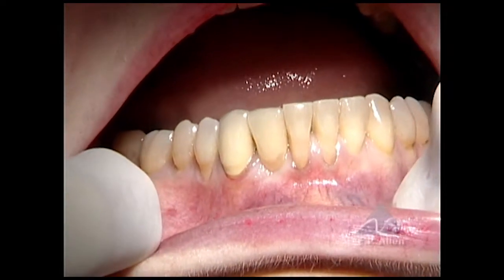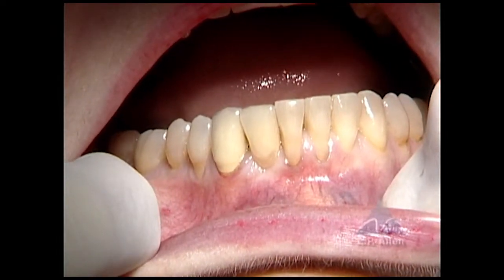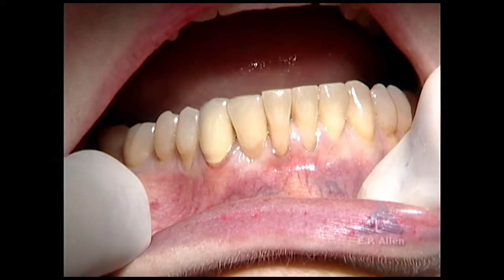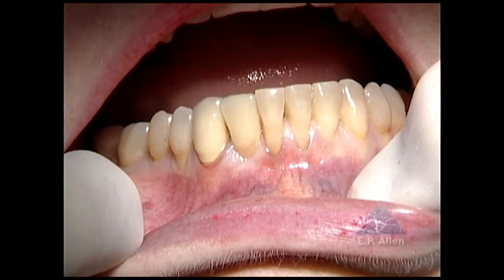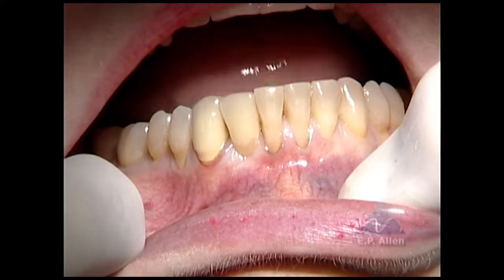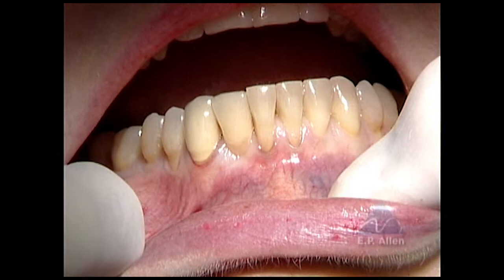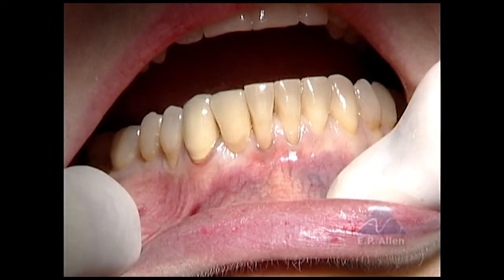You have a nice view of recession on the central incisors, and the tissue is very thin there as well with no attached gingiva. Tooth number 26 is missing — that's a cantilever prosthesis with a crown on the canine.